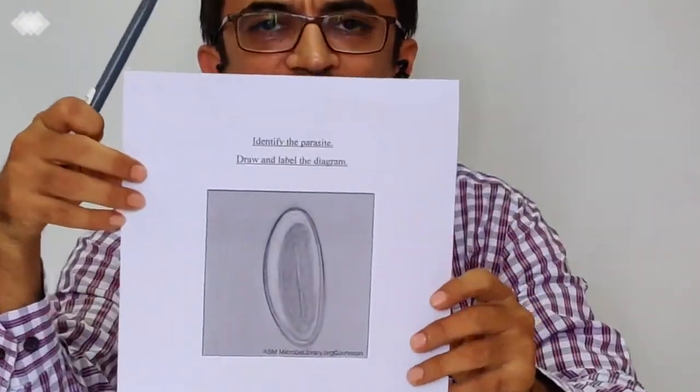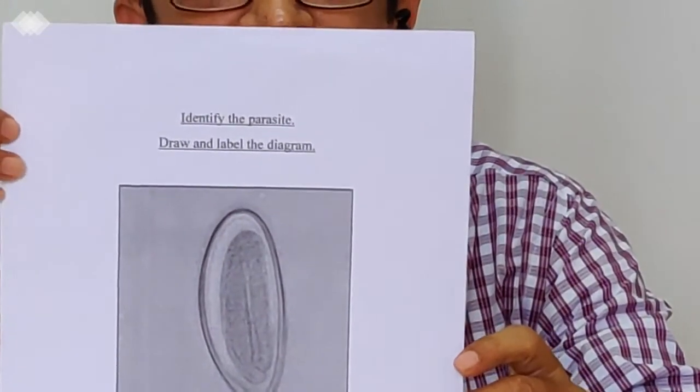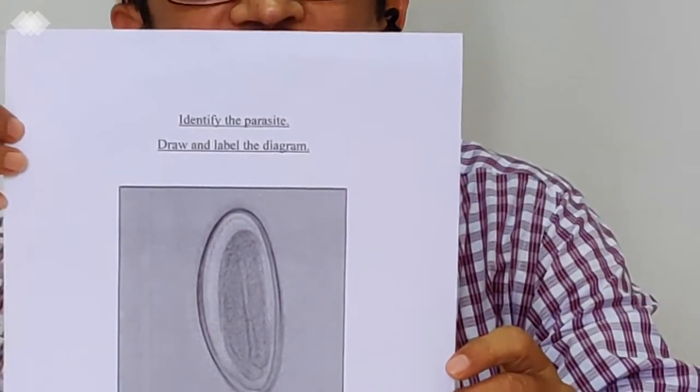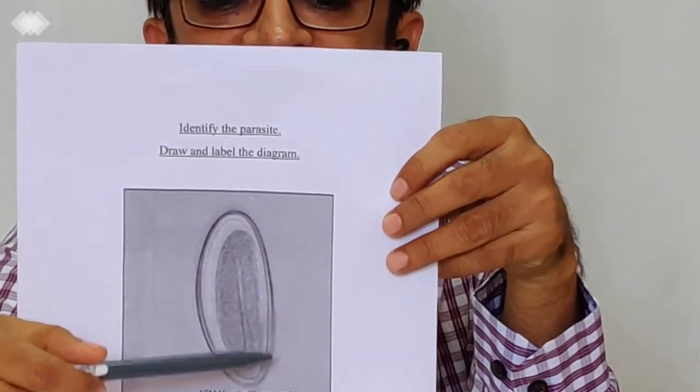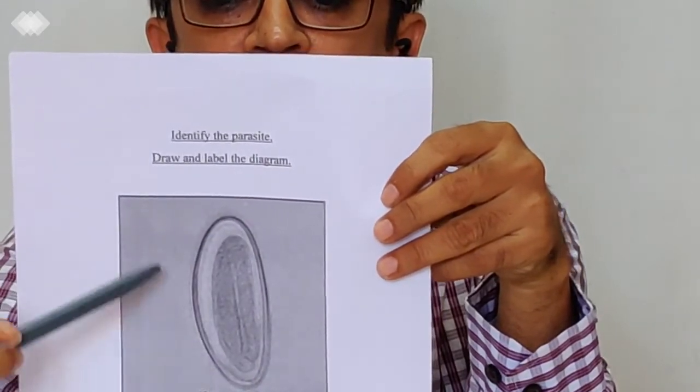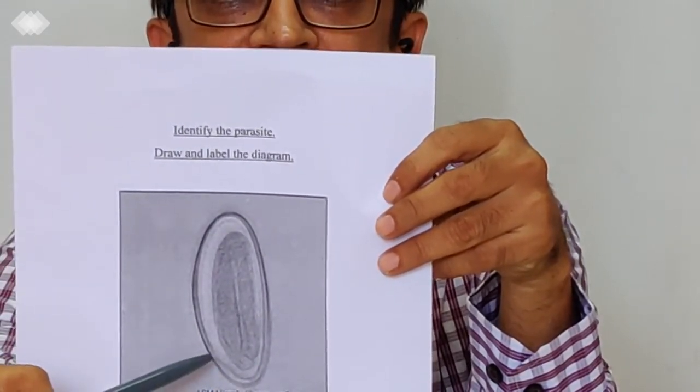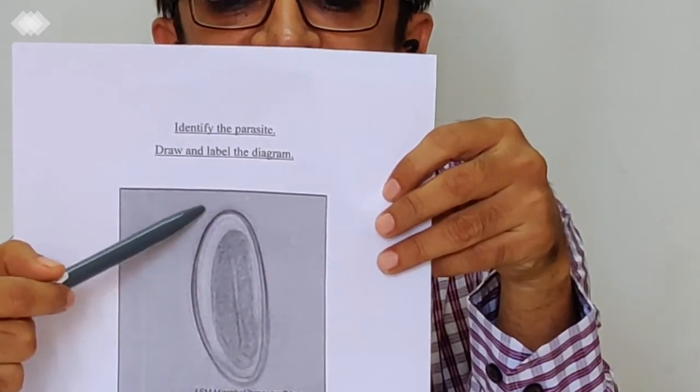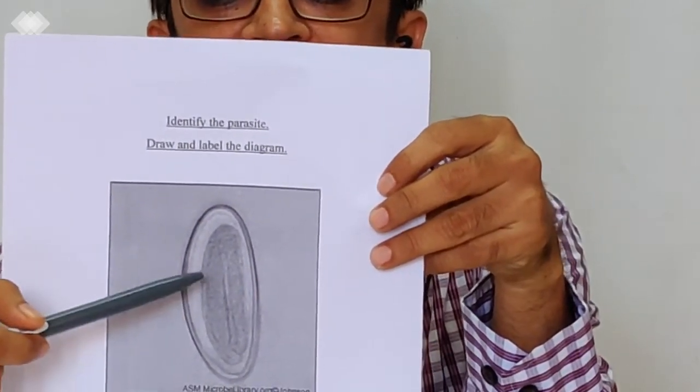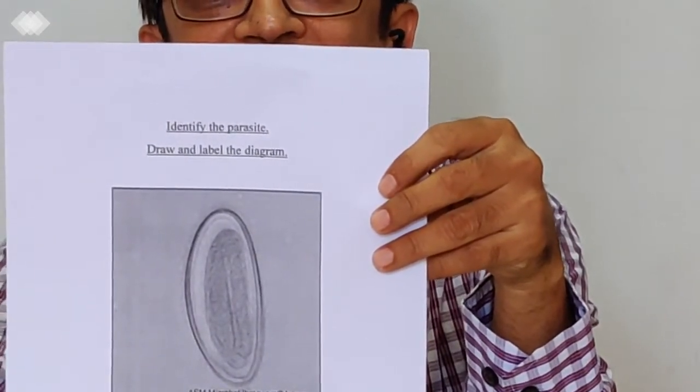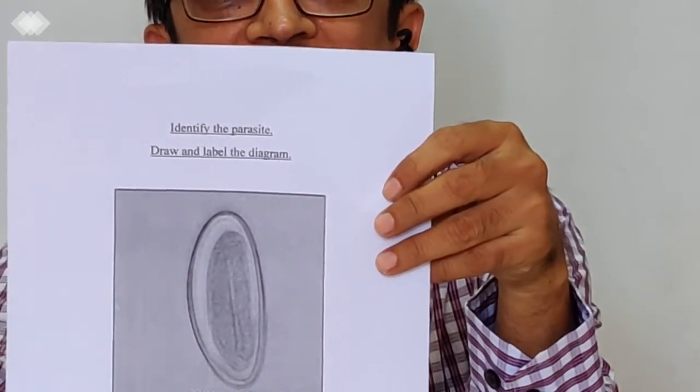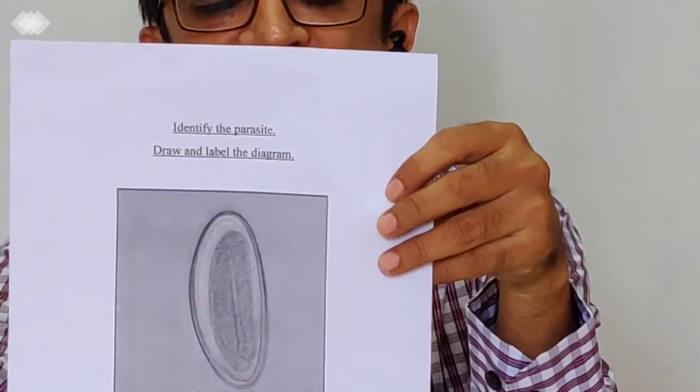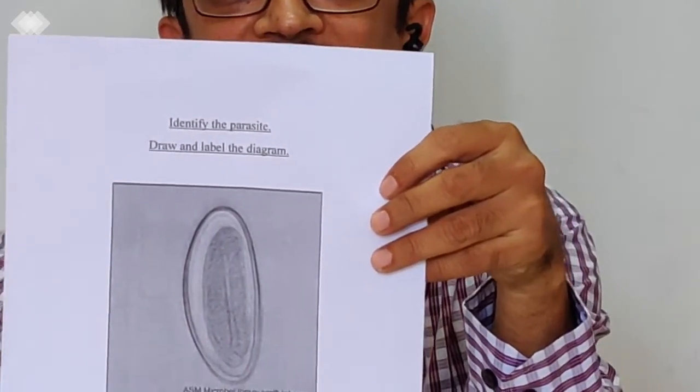And the last egg which we see is the egg of threadworm, or the pinworm, that is Enterobius vermicularis. The peculiar characteristic of this egg is its shape. It is known as plano-convex shape. One side is relatively flat, and one side is convex. And this egg can be seen in the NIH swab. Because, this egg are laid on the perianal skin. And in NIH swab, it would stick to the cellophane tape, and you can see that.